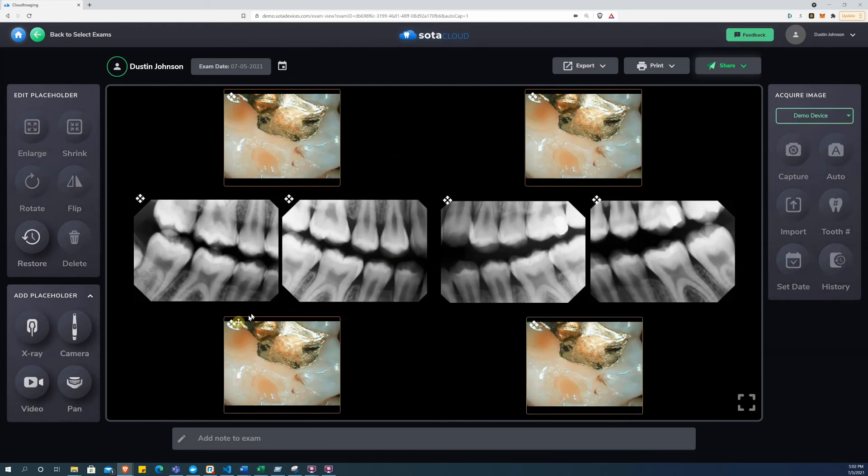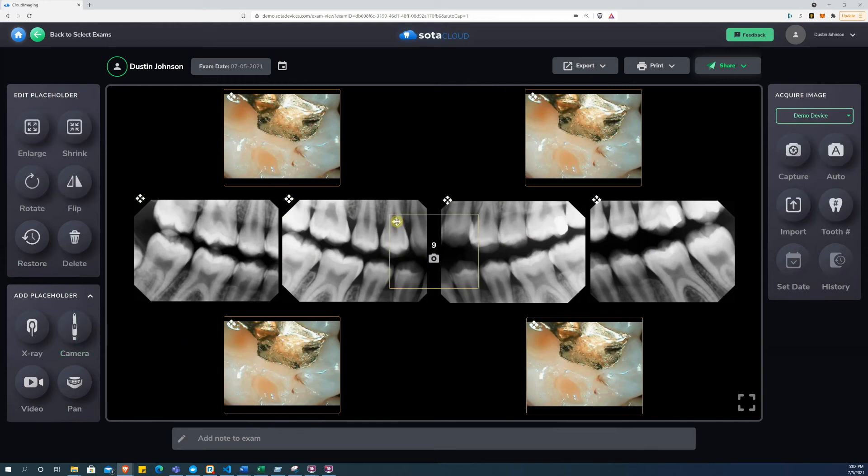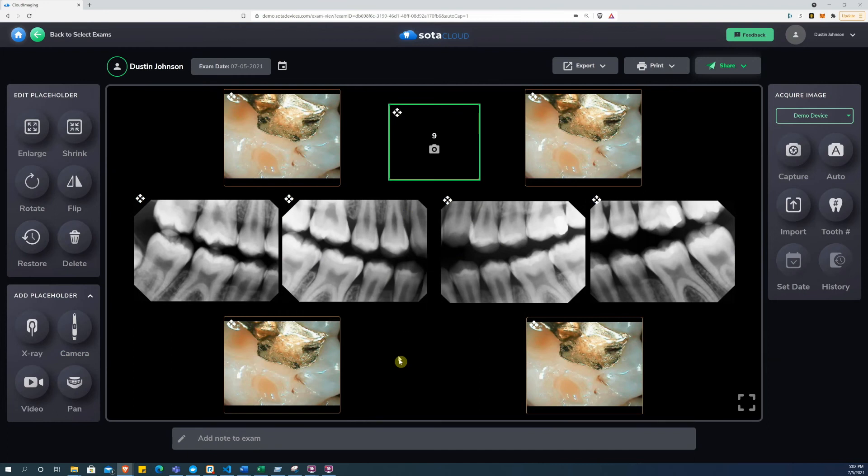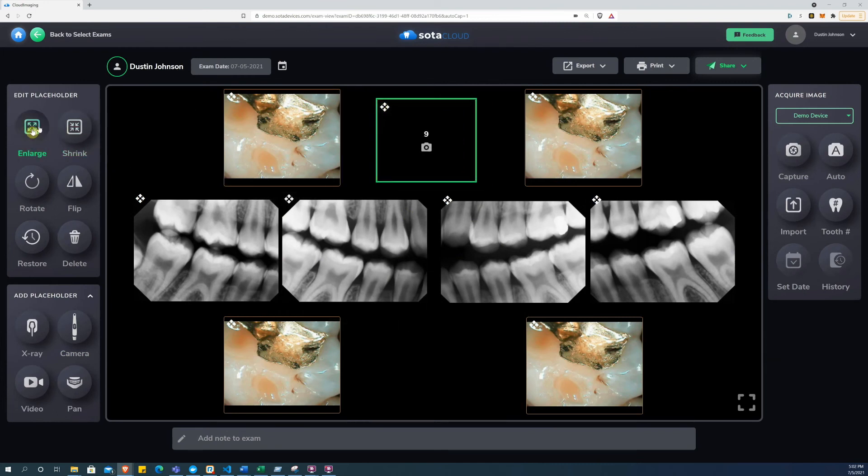For example, to add another camera placeholder, I can click the camera button and then position it in the exam where I want it to be. I can also enlarge and shrink as necessary to make it fit in with the rest of the layout.